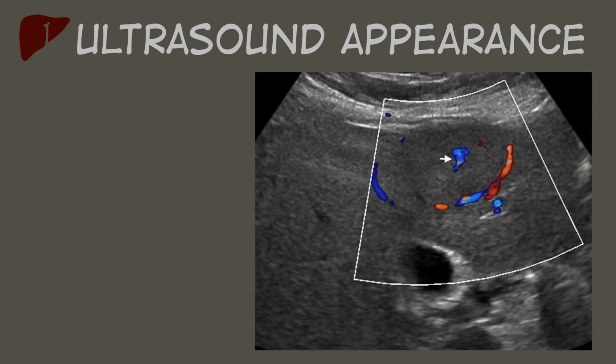Another thing that might be apparent on FNH nodules is the appearance of a central scar. Now the central scar, when the color isn't on the image, appears as a hypoechoic area, kind of like a belly button to the nodule. Once we put color on, that belly button will fill with color. Also, the vascularity around the periphery of the nodule will also light up.